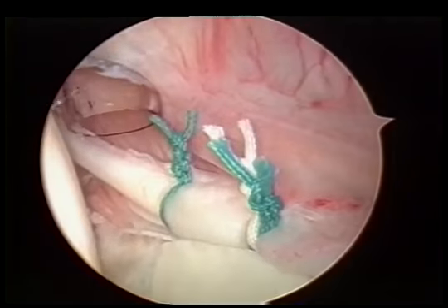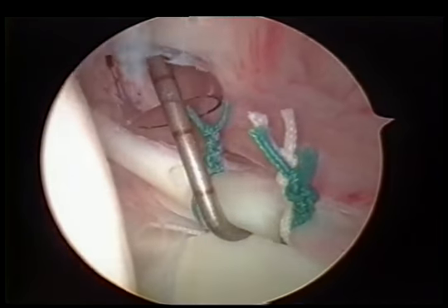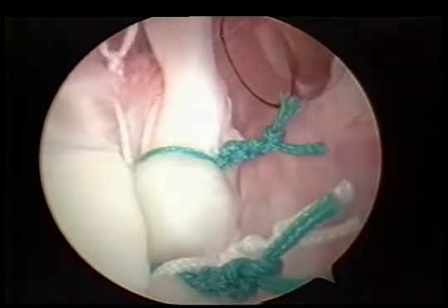Now we'll show our completed repair, and we'll take it through a peel back maneuver. Here's the completed repair with 4 sutures and 2 suture anchors. You see this is very snug and firm. Now we'll test the peel back test and take the arm into abduction and external rotation.